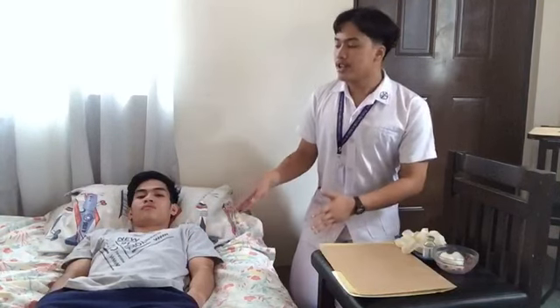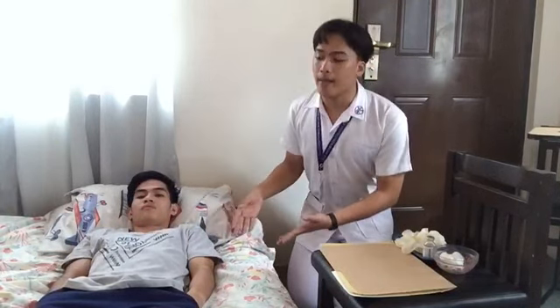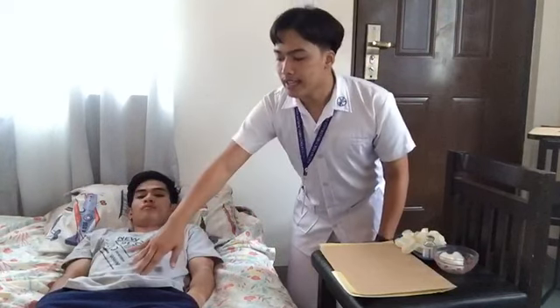Next is assist the client to the position in which the arm, leg, or abdomen can be relaxed, depending on the site to be used. So the position that I did is the supine position, and I am going to inject in this site, which is his abdomen. So next is obtain assistance in holding an appropriate client. So sir, makasabot man ka og Bisaya, di ba? Okay, that's good.